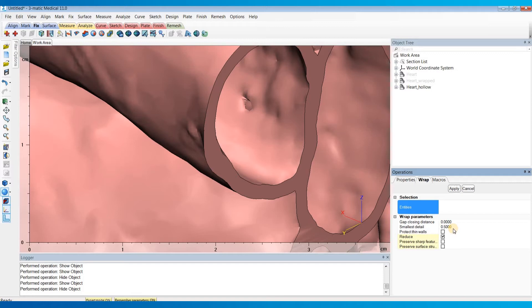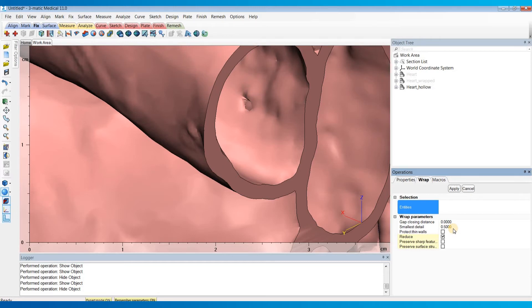So one option to fix this would be to go back and edit our segmentation or redo the wrap operation with a smaller detail level. But this can take a long time, especially if you've already done other modifications like smoothing, cutting, or labeling, as you'll have to redo all of those edits as well. To avoid this, we can do just a couple easy steps to get rid of these holes.